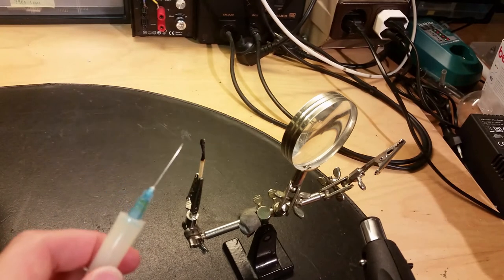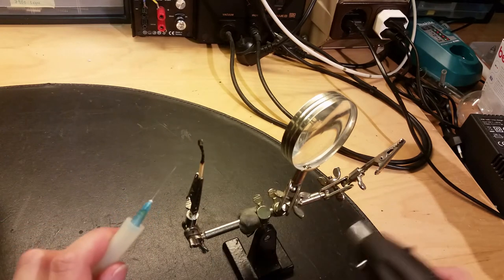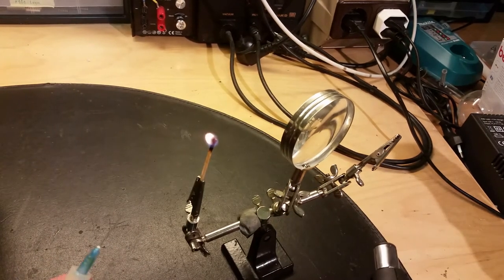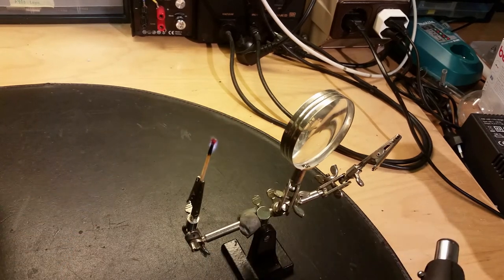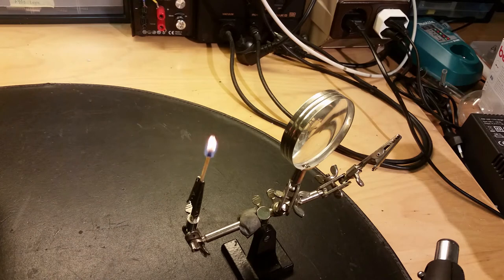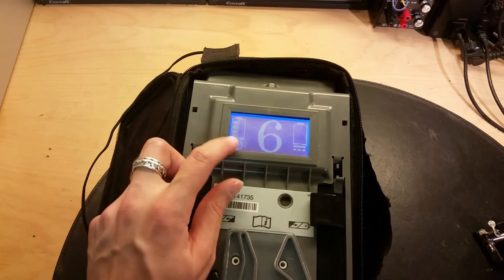I think the oxygen concentration here is not that much - it looks more like it's blowing it out. Let's try another match. Now it just blows the flame out. That's not how it's supposed to be. So yes, there is obviously something wrong with this oxygen concentrator.